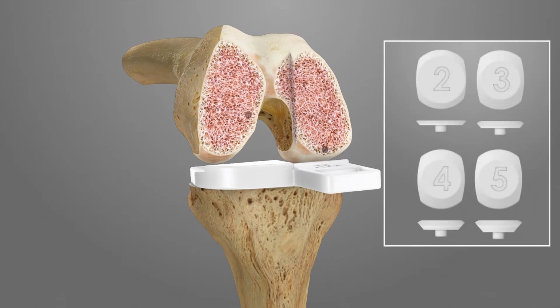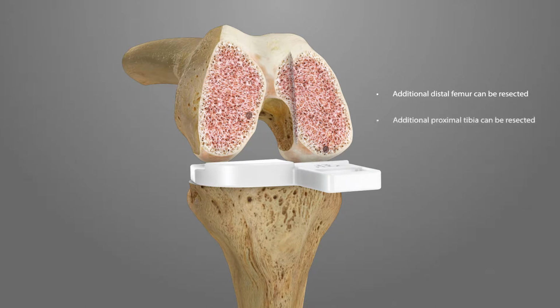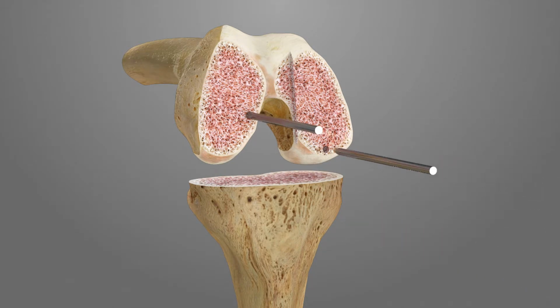2, 3, 4, and 5 mm shims are provided in case of posterior condylar cartilage loss. If the knee is appropriately balanced and aligned, proceed to final femoral preparation. If required, additional distal femur can be resected, additional proximal tibia can be resected. The degree of flexion laxity can be modified by adjusting the position of the AP resection iJig, F4, or ligament releases can be performed. Place 2 Steinman pins into the previously marked holes on the distal femur.